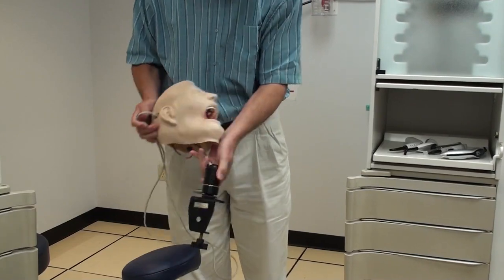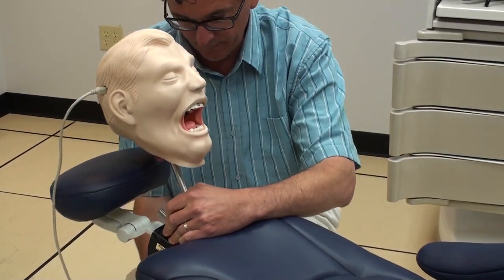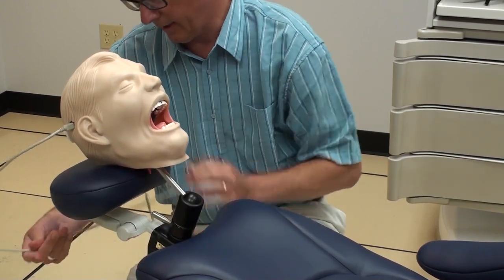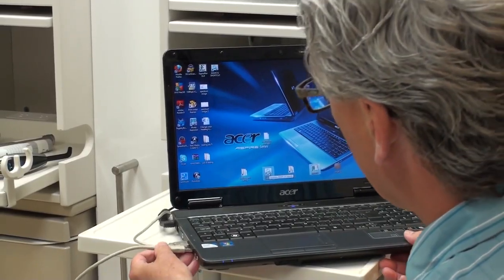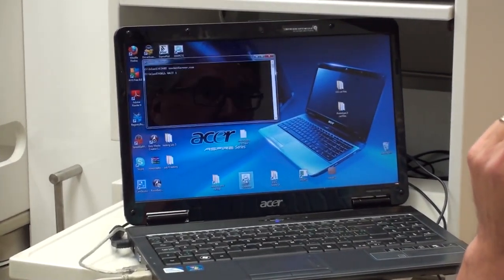So here's the MARC unit with the USB cable already attached to the spectrometer inside. There's the universal mount, which will now attach to the back of the headrest on the dental chair. We'll adjust the head to the appropriate position and tighten things up. The other side of the cable will now attach to the laptop. Once the USB has been attached, we can start up the MARC software.